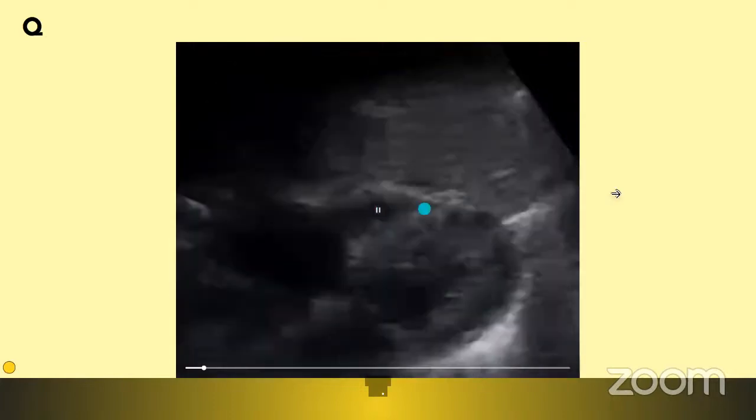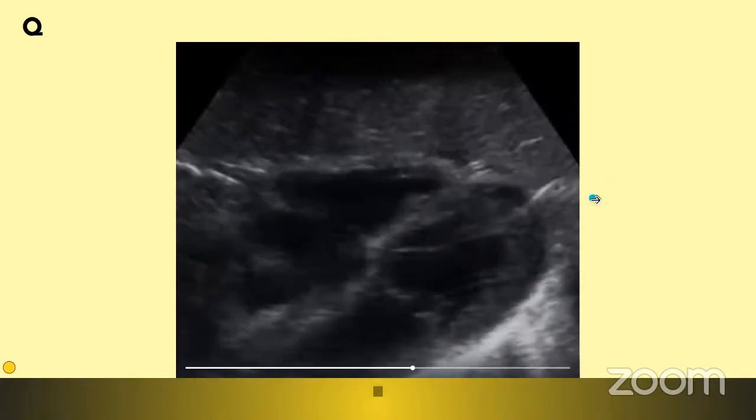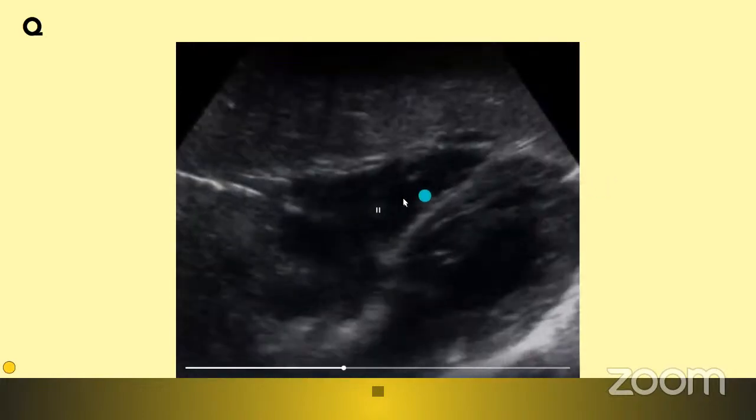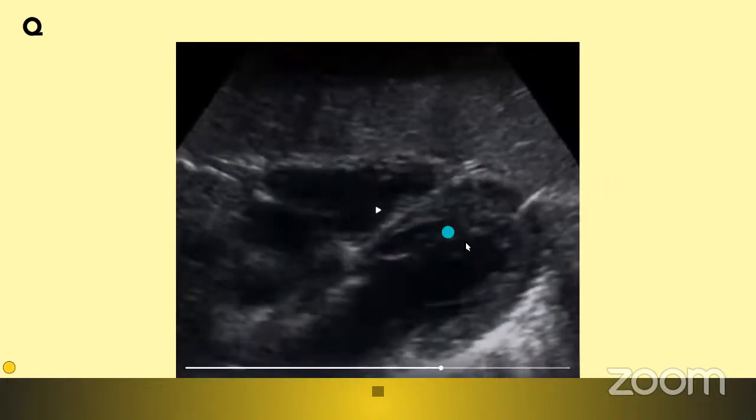Much shorter video indeed. Again, let me play it again. Yeah, I'm freezing it here. So these are the four chambers: ventricles, atrium, and since I told subxiphoid, can anyone guess what is this solid area? Yes, that is the liver.